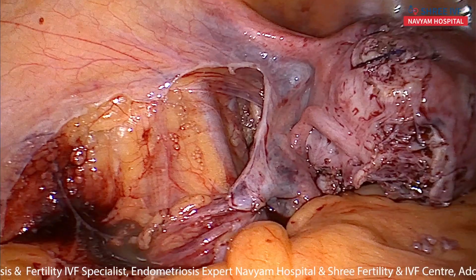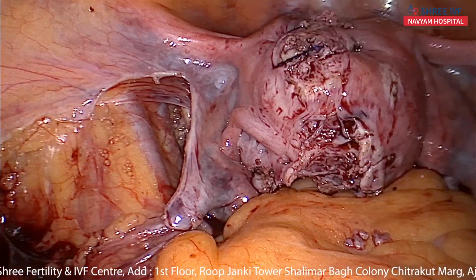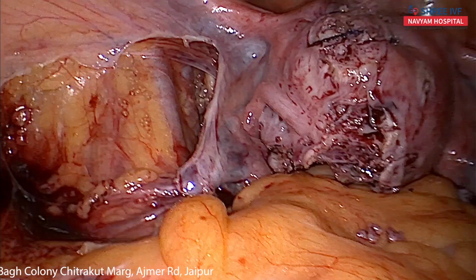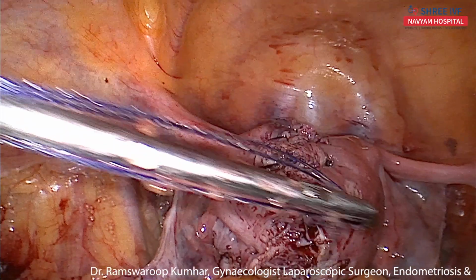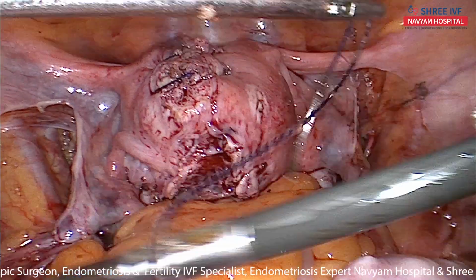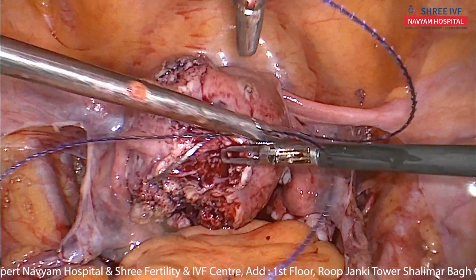Our anesthetist is telling that we can do all these laparoscopic surgeries in spinal anesthesia also, and we usually do it together where the resources are less in smaller centers. But here we are using general anesthesia only at our center for all the laparoscopic surgeries.